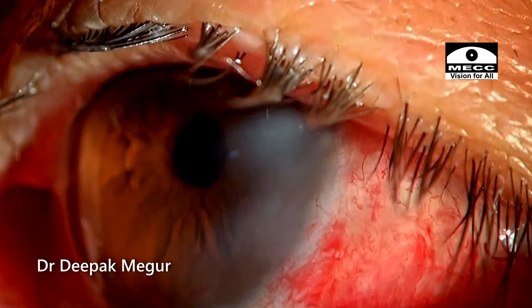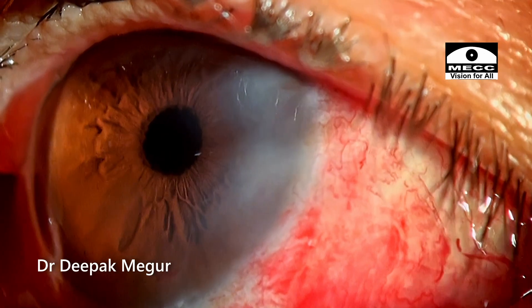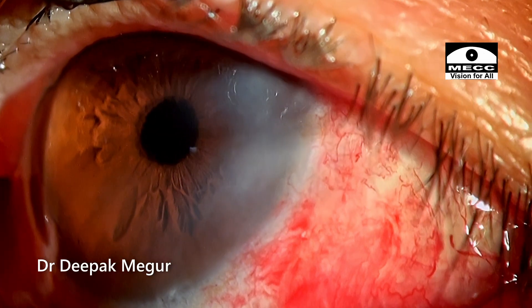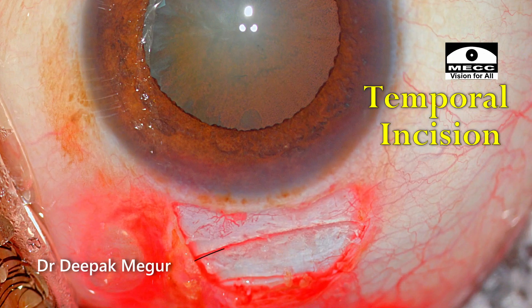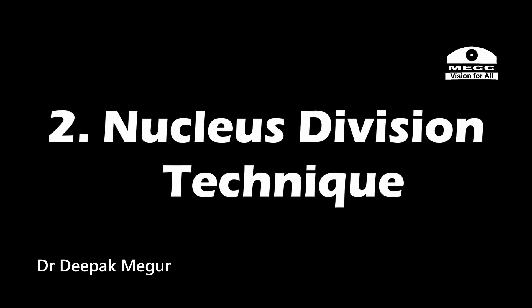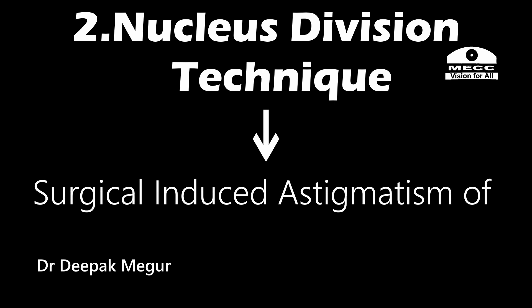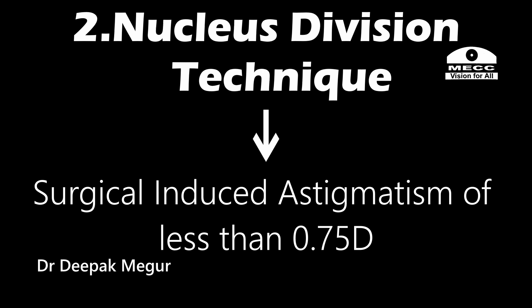The only disadvantage of the temporal incision is that some patients might have subconjunctival hemorrhages at the incision site, which would bother a few patients. But temporal incisions are clear winners over the superior ones. Moving on to the next aspect and the more difficult one — manual nucleus division techniques. A surgeon can consistently achieve SIA of less than 0.75 diopters if he or she can master the nucleus division techniques and also use the temporal incision.